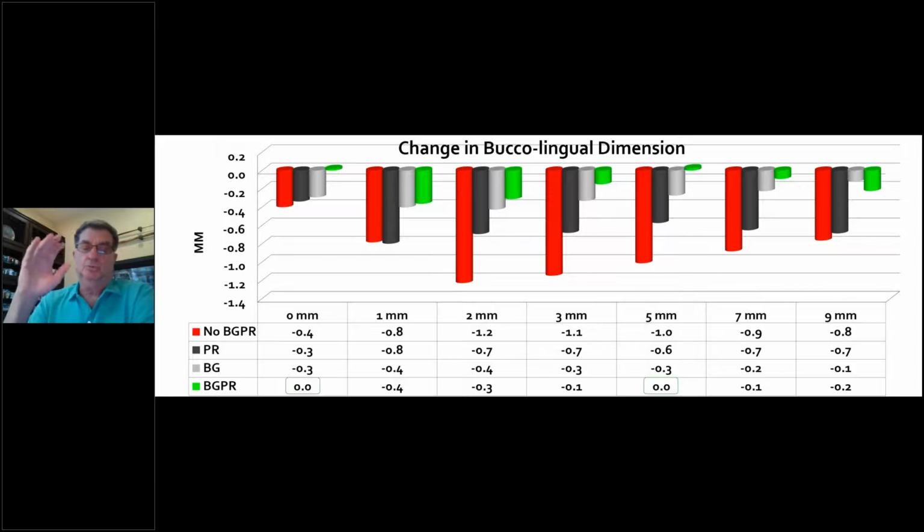I don't have the time to go through that wound healing, but whatever you put into the gap does not affect what's up against the implant. It's the same as if you just set a clot in there. I'll say that again. Whatever was going to form with a clot in the gap would still take place. The only difference is that due to some resorption of that buccal plate, because it's so thin, the tissue is held out in a ridge shape. It's filled in with bone, but the ridge is prevented from collapsing in as much if you put a graft in. And that's what this shows.